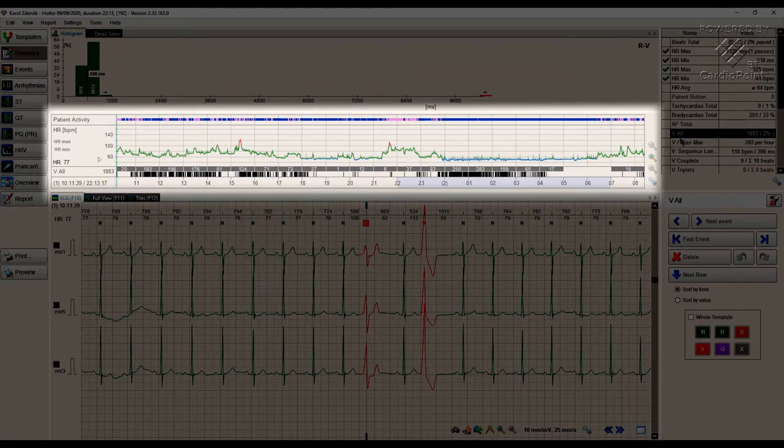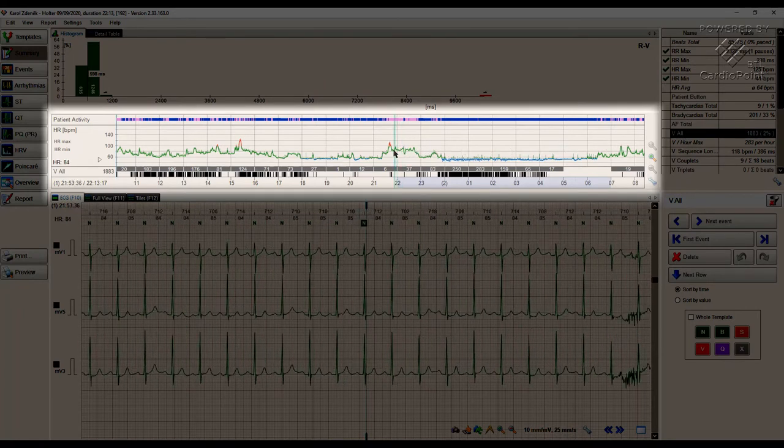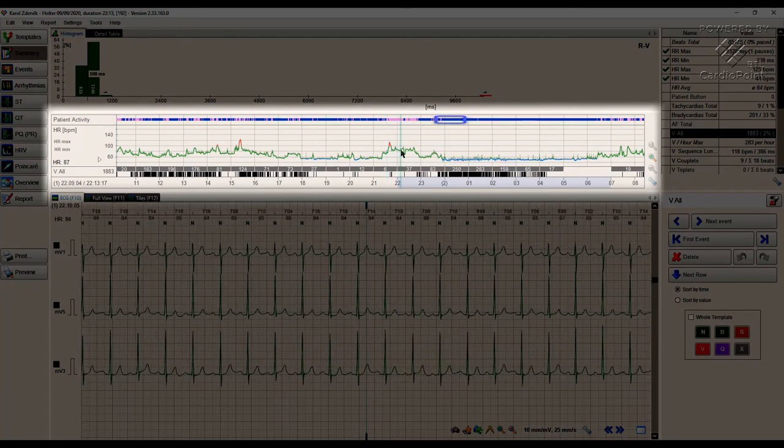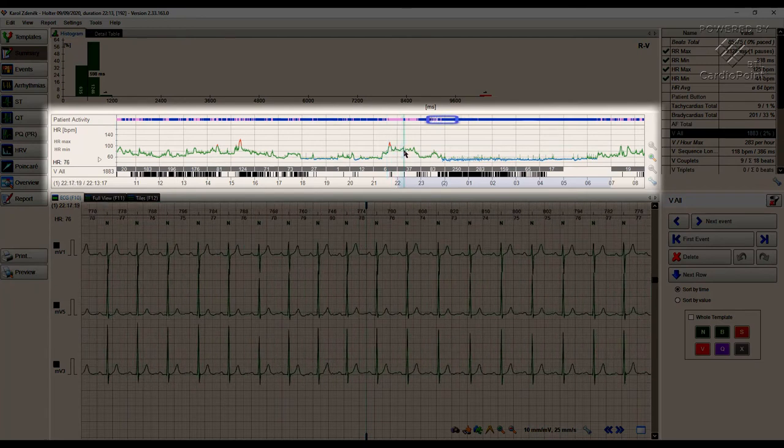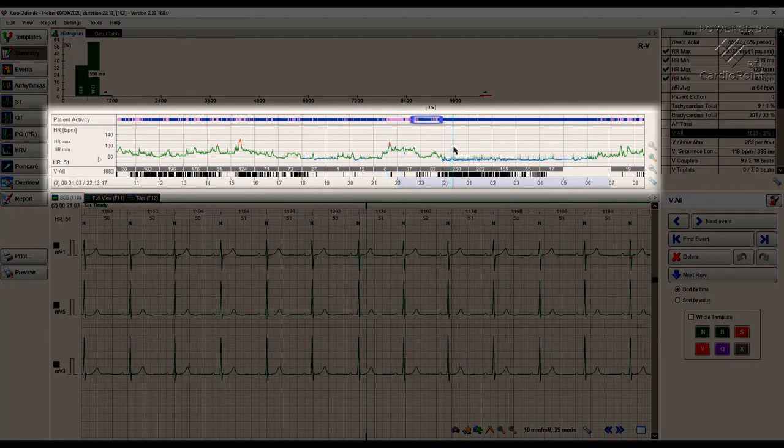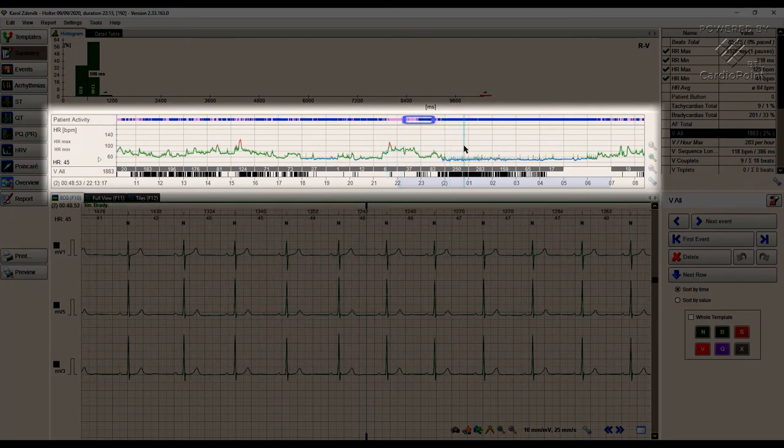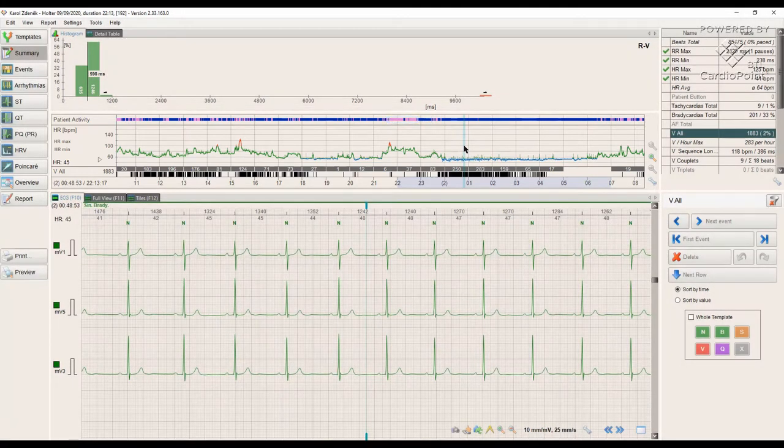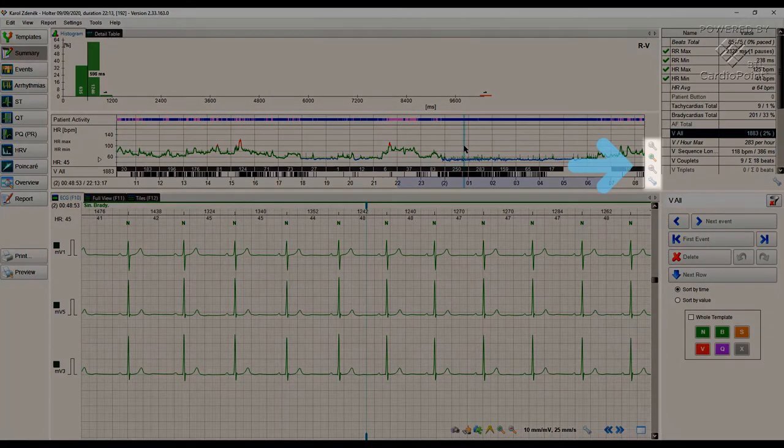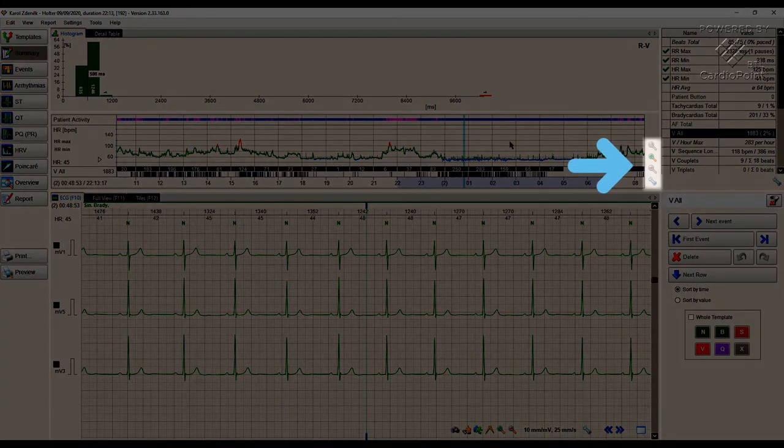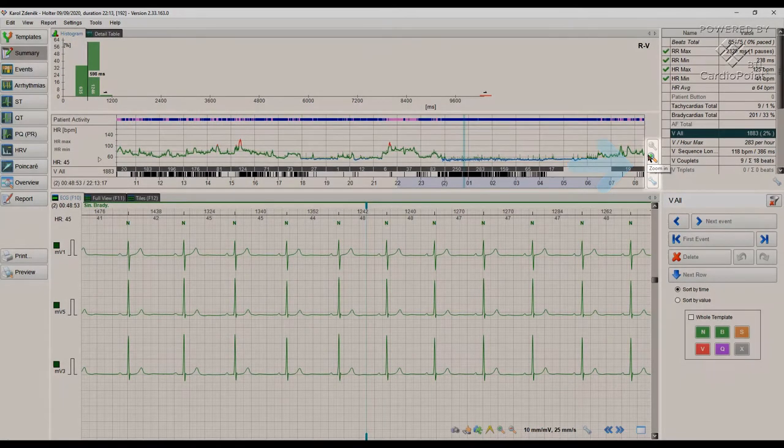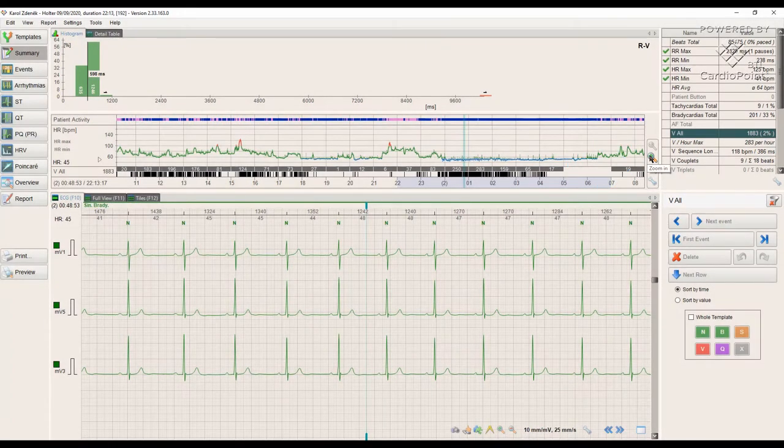The Patient Activity Row shows the data from the recorder's accelerometer. Blue color indicates that the patient was resting and pink color indicates that patient was active at that time. On the right side, we have controls to zoom the trend in and out.